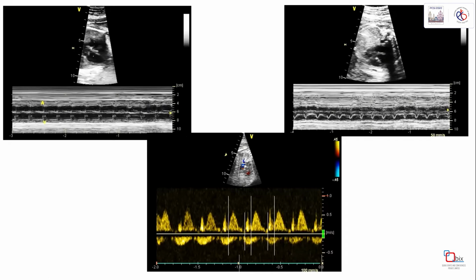Most of the time, if it's less than 100 milliseconds or if it's less than 50% of the RR cycle, then it's considered to be a short PR, long RP tachycardia. So this favors an ectopic atrial tachycardia, or a PJRT rarely.